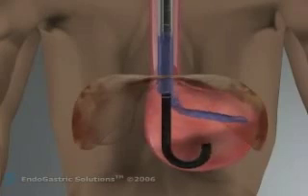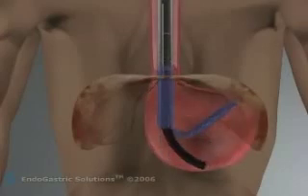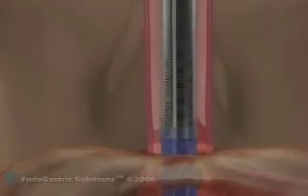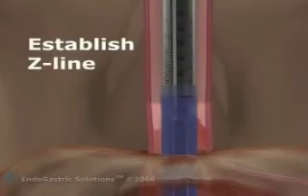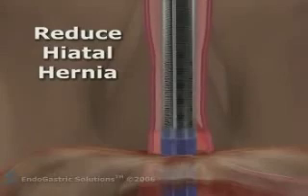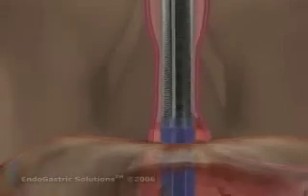As you can see, every step of the esophagus procedure is performed under visualization and through a clear window. The operators can precisely line up the device through a series of simple maneuvers to position its marker at the Z-line. Prior to starting the case, the esophagus is lengthened and positioned by engaging the invaginator and gently repositioning the Z-line at the level of the diaphragm.